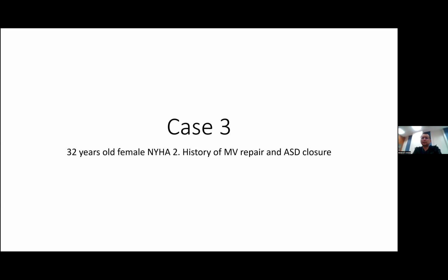So even though it's good as a rule of thumb, something to make you suspicious, you can never just use it. Even though I love echo, I don't think echocardiogram alone is enough to differentiate all these different cardiac tumors. It's interesting, but ultimately you need some other modalities.